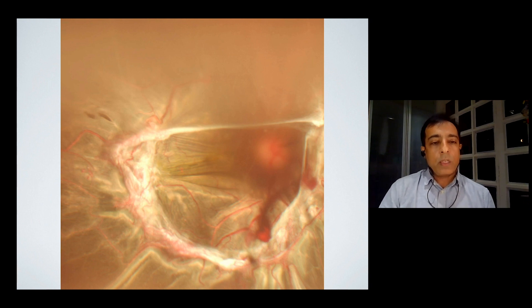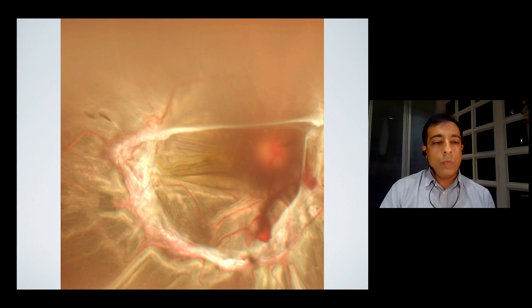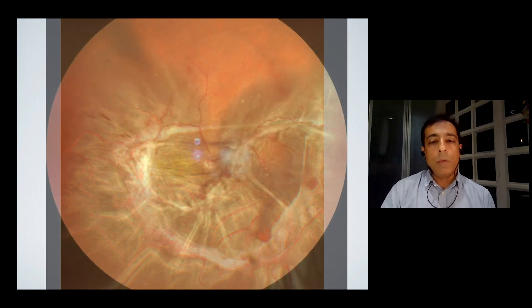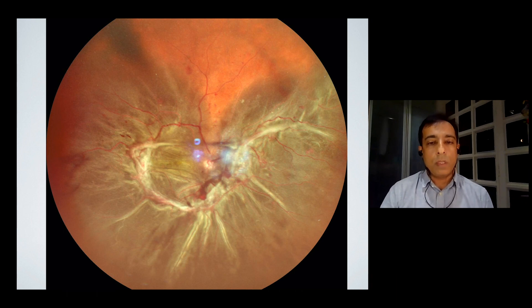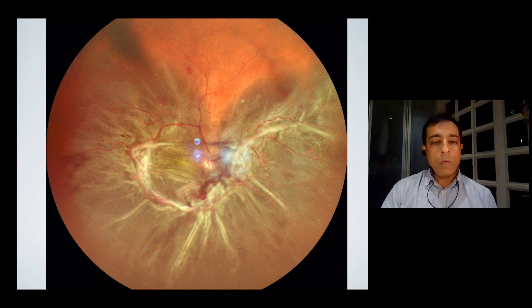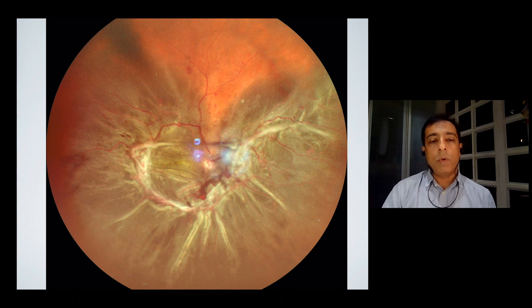This is a tractional rhegmatogenous detachment. You see the proliferations and the traction, and there's a hemorrhage in the central part, and then you see two breaks temporally. As you go to the wide field images, you see the whole extent beautifully — the extent of the detachment, as well as how the proliferations and the tractions extend. It gives the surgeon an idea about how one should progress, and it helps us explain to the patient the extent of the disease and the prognosis.